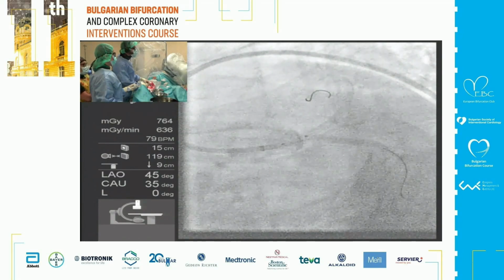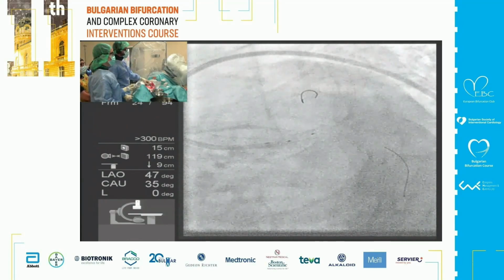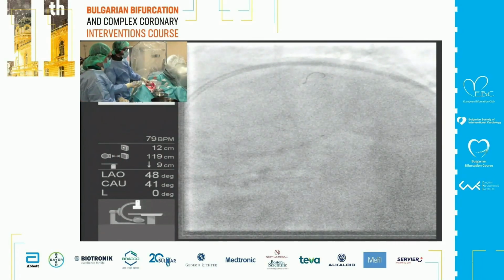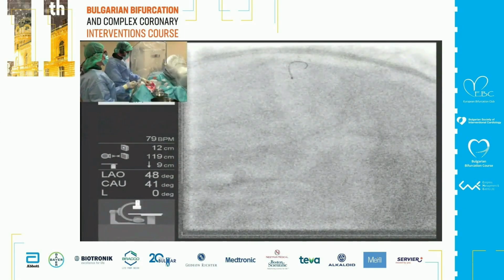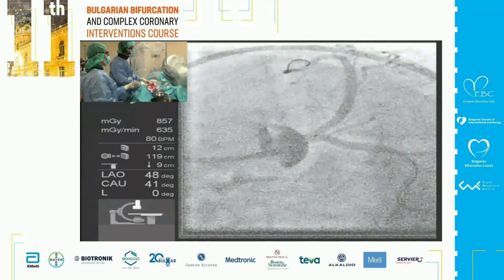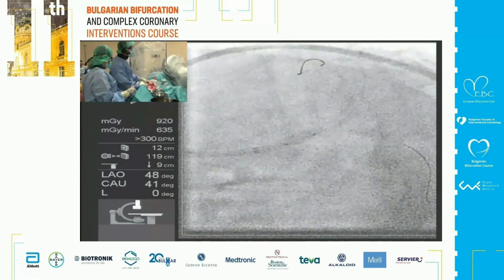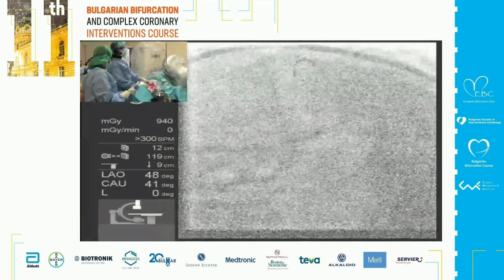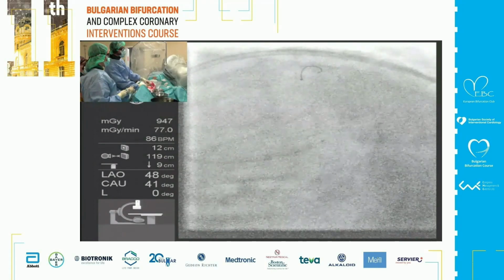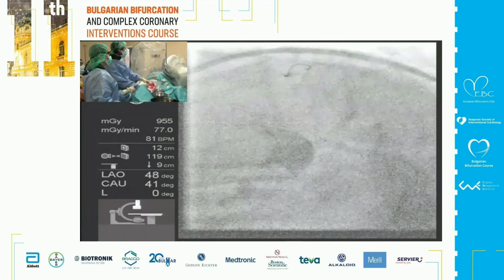Yeah. Maybe a bit more caudal, if you can. So this is a 12 millimeter balloon? A bit more caudal, if you can. It's okay. It's 10. Okay. Yeah, I know this is not good for X-ray, but just a second. Do a test. This is not good. Go. Yeah, a bit more. 10, 12, 14. Yeah, he's doing. Okay. It's not distal enough, in my opinion. If you pull your side branch wire after POT and it removes easily, is that POT enough? Okay.